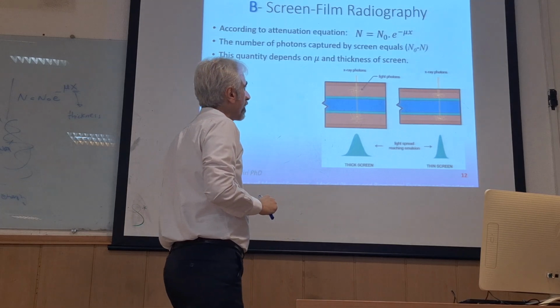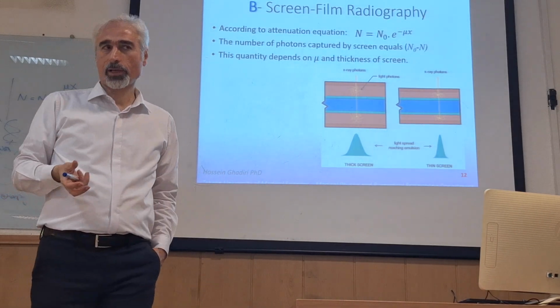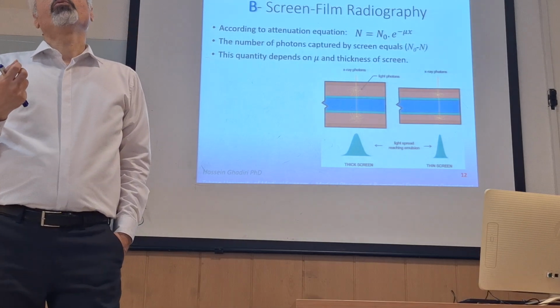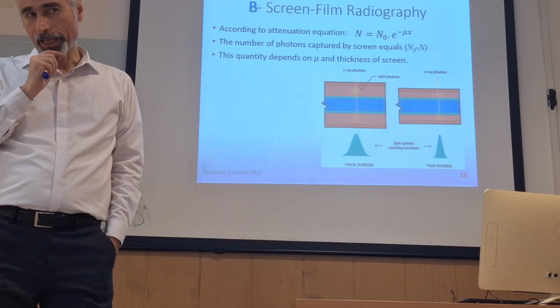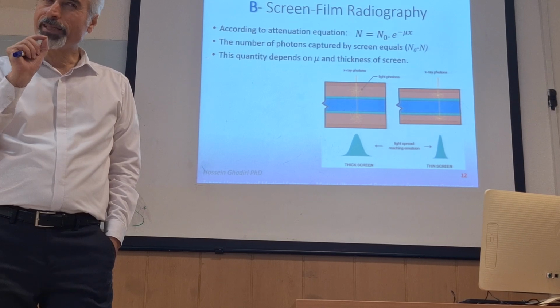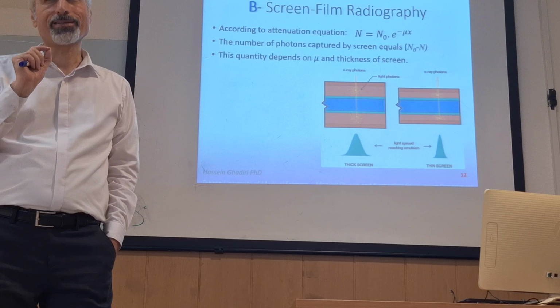What are the applications? For example, in mammography, one of the symptoms of cancer is very tiny microcalcifications inside the breast tissue.